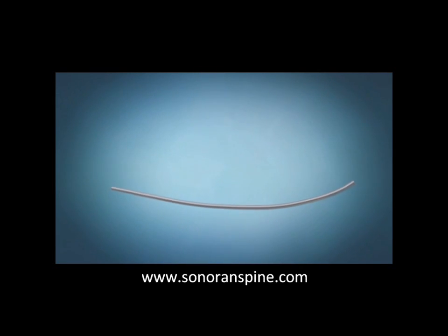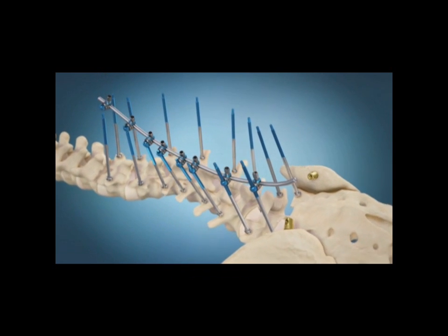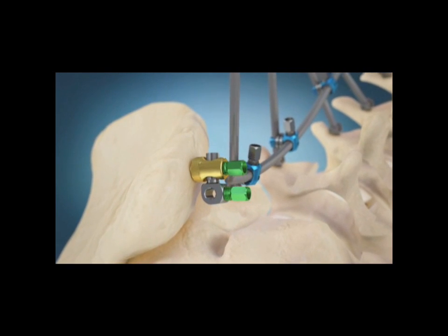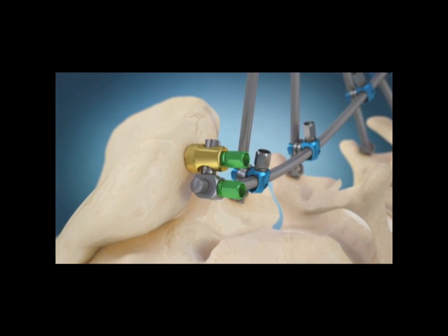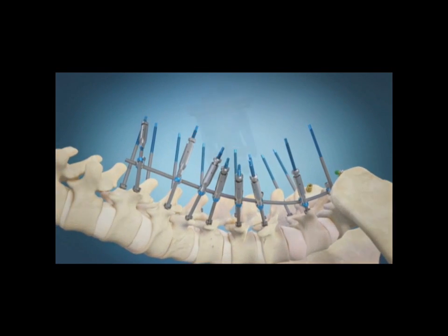Then, with the translational technique, it's important to bend the rod like you want the spine to look. So, putting enough arch in the low back to correct the sagittal plane and correct the scoliosis also. Once the rod is placed, just sliding it down over those posts of the 3DX screws, it can be slid into the iliac screw. Notice the distance between the rod and the spine.